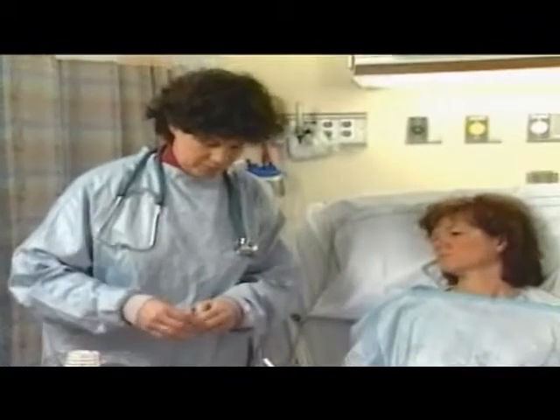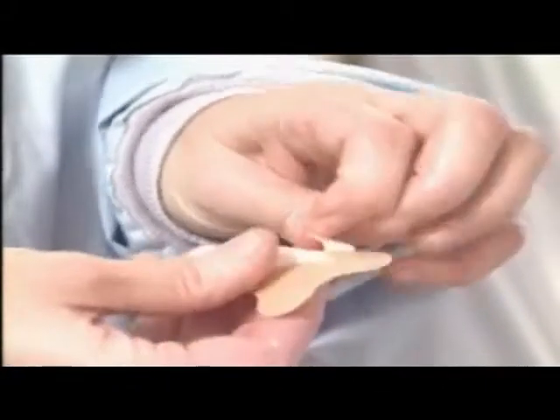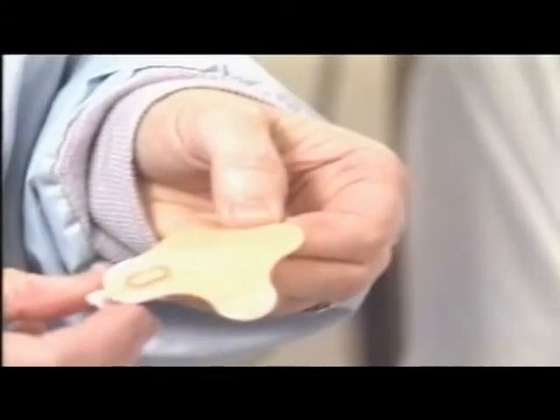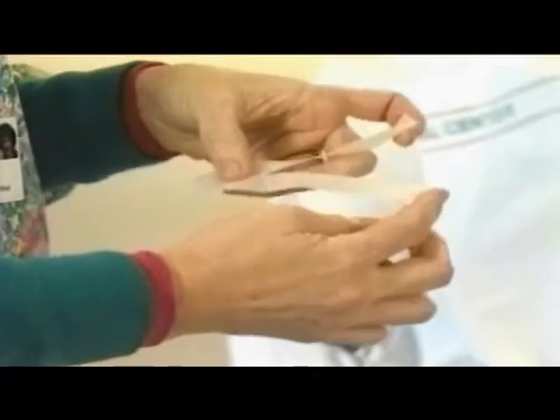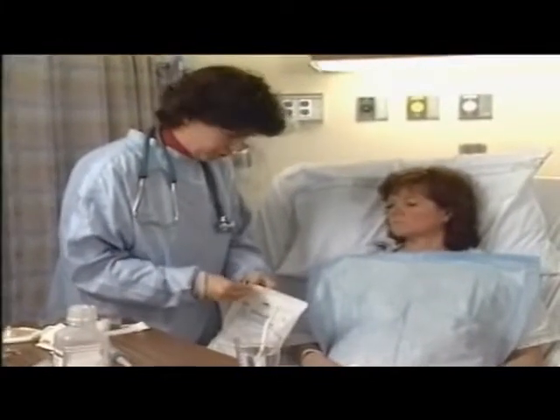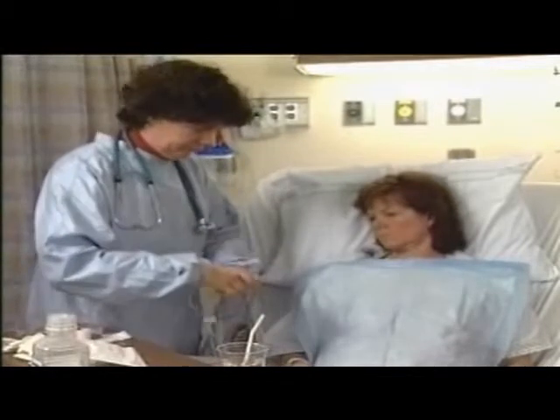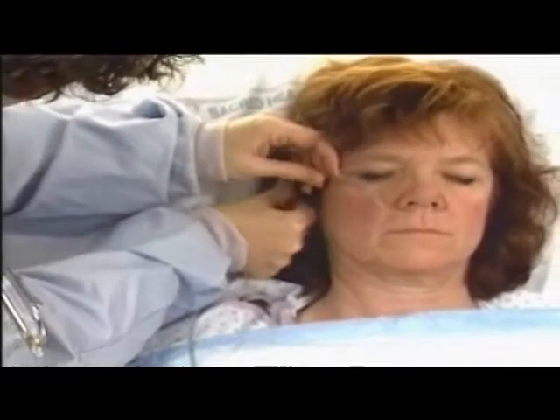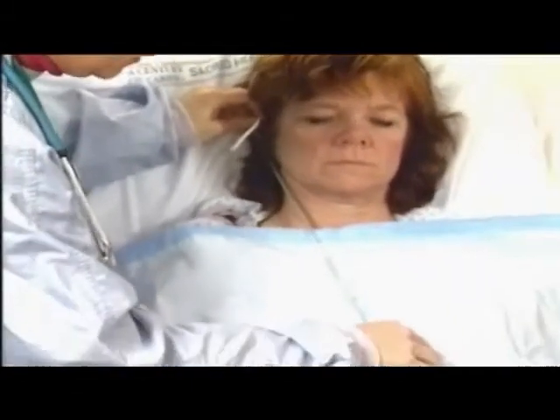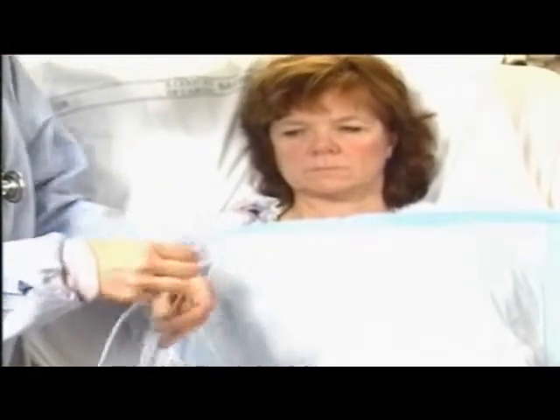To attach the tube to the nose, prepare a tube attachment device, or use a piece of tape approximately four inches long, split one end lengthwise in the middle about two inches. Place the tape close at hand so it can be easily reached. Measure the length of the tube to be inserted: begin at the tip of the nose, to the earlobe, to the xiphoid process. Mark the length with a piece of tape, which can be easily removed.